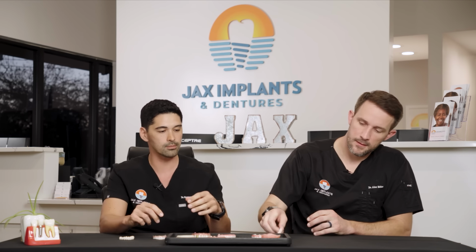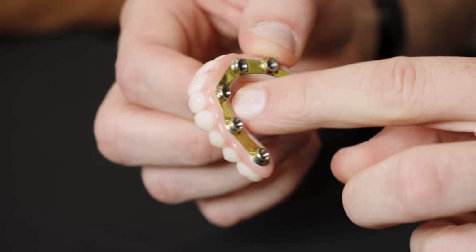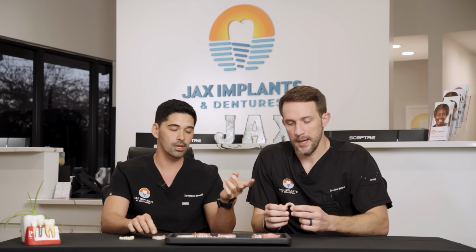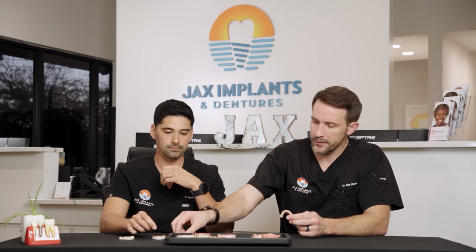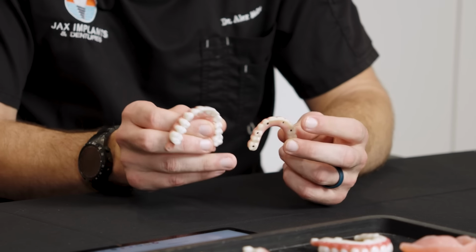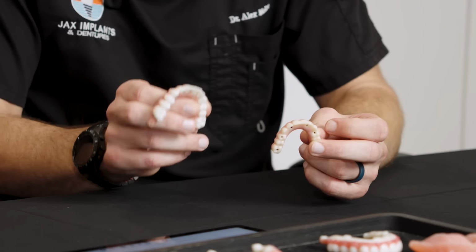We also have something that you were talking about, the long-term temporary option. We'll do this sometimes, and this is going to be the same titanium bar that we have in the permanent, the very same exact process. The only difference is what's on top of it. You may be looking at home and saying, well, these look kind of the same. This is actually a temporary material, and this is the final material. You would know if you were holding it.